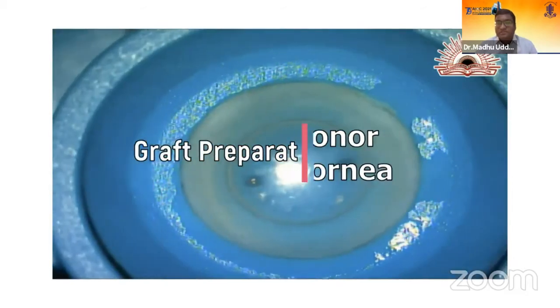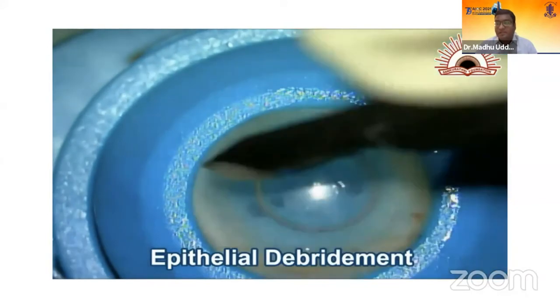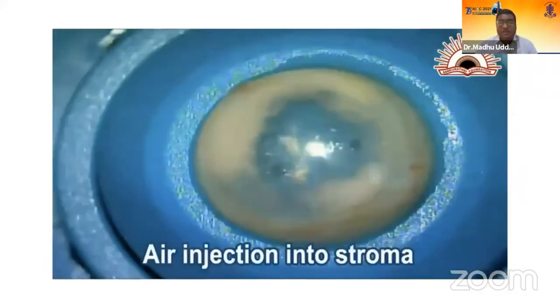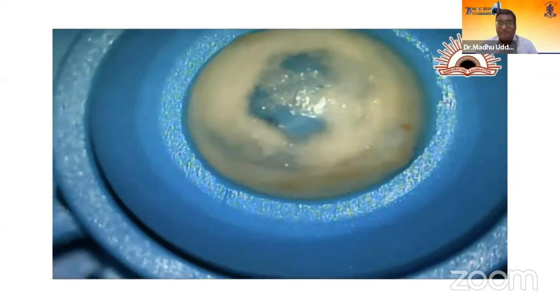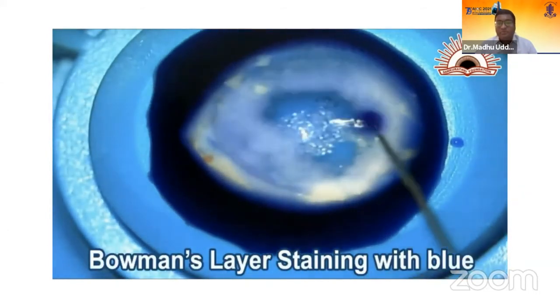So this is the donor cornea preparation where you debride the epithelium with a number 15 blade and then inject air into the underlying stroma to delineate the Bowman's layer and the anterior stroma from the beneath. Once that is done, you dye it with trypan blue.